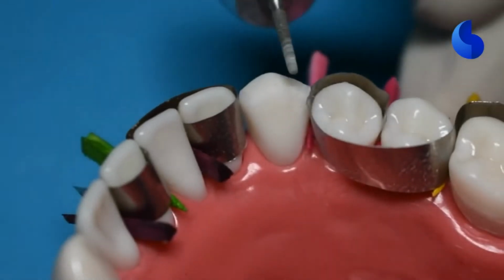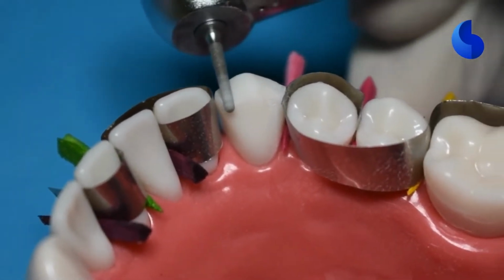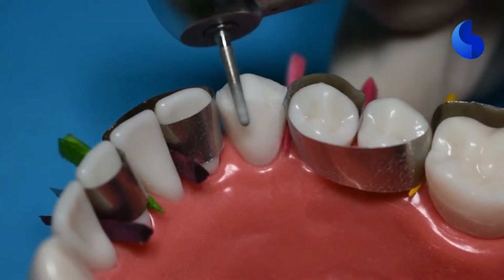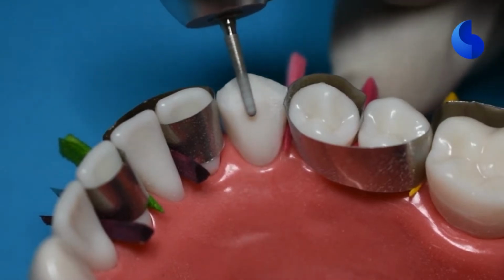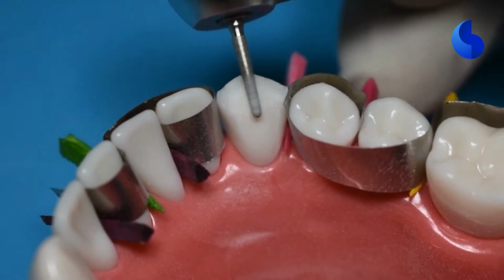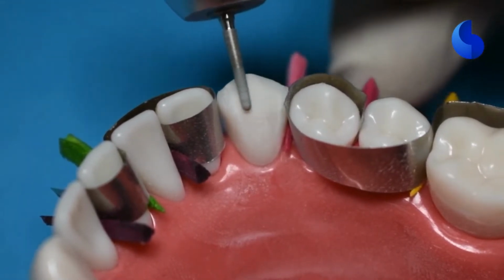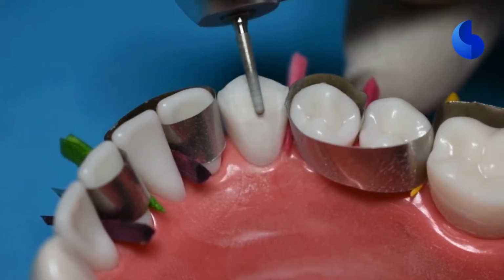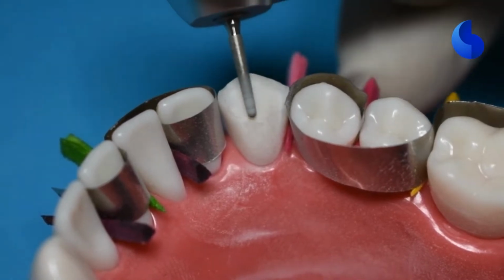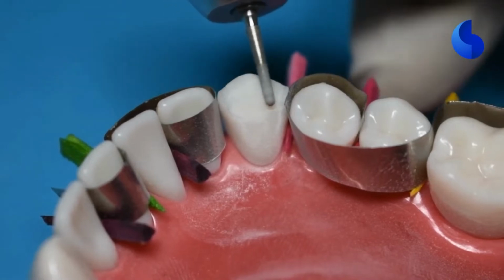Once you've verified that you have sufficient incisal reduction, go on to the lingual and place this bevel that is basically perpendicular to your opposing tooth structure. This is to give enough bulk to the surface that's coming in contact with the opposing tooth so that the porcelain has sufficient bulk to withstand the forces that the opposing tooth is going to place on this incisal lingual portion of the tooth surface.